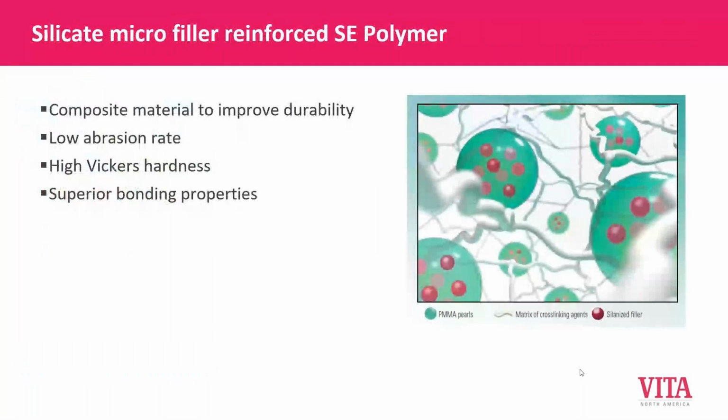The Vigo teeth themselves are made from a silicate microfiller reinforced SE polymer, which is a bunch of big fancy words to say that it's very hard and has a very low abrasion rate. Okay, it's a composite material. It's got great bonding properties and very durable.